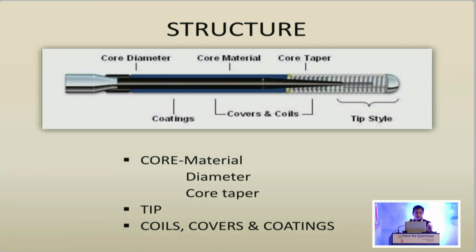So what is the normal diameter of the guide wire? Okay. I couldn't hear anyone. 0.014 inch is the normal guide wire diameter.